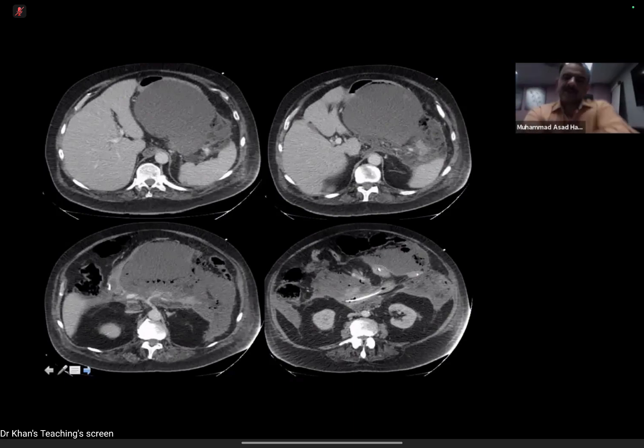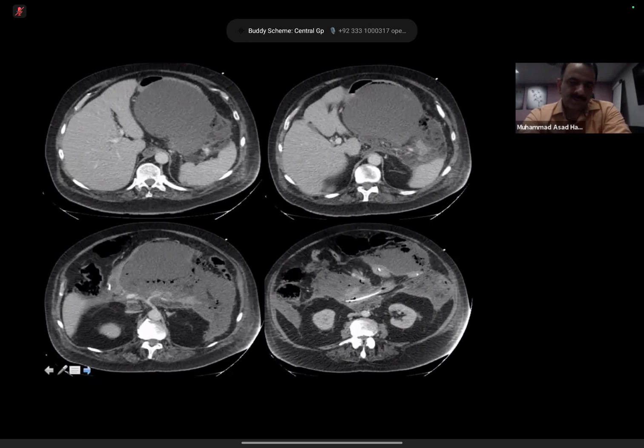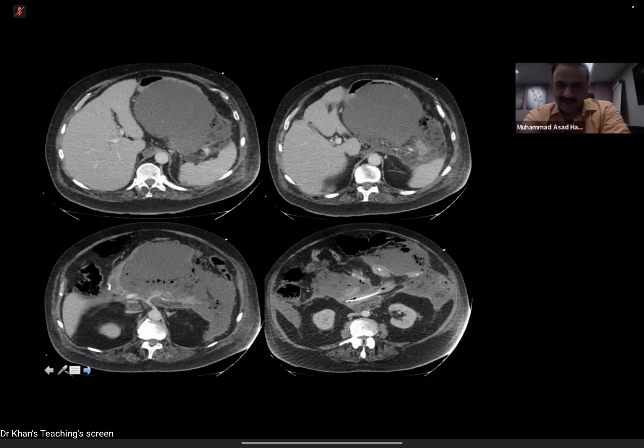Okay. Now, you rightly pointed out the observations. Just to guide you, the cystic lesion, which you can see in the top two images, you can actually see the stomach is collapsed next to it. You see along the anterior border. If you see, you can identify that there is some wall or at least enhancing bowel tissue with some air on one side. And in the second image, that air is basically outside that wall. Would that help you in coming to a conclusion of what it could be?